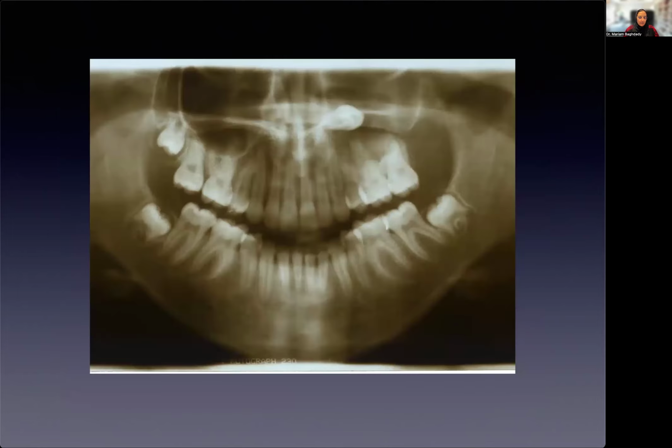So when they did a CT, this patient has a huge cyst that completely obstructed the osteomeatal complex. And basically what happens is you get what looks like a cyst and a mucocele, and this actually went all the way up to the floor of the orbit, and the patient had a lot of problems, but the patient basically sued the orthodontist for not seeing it.